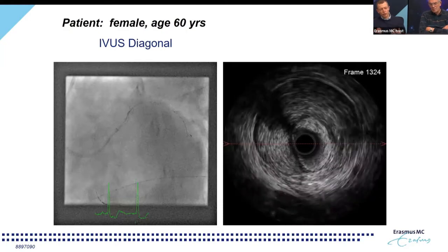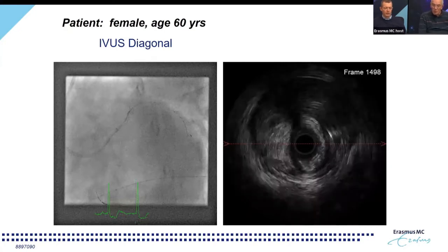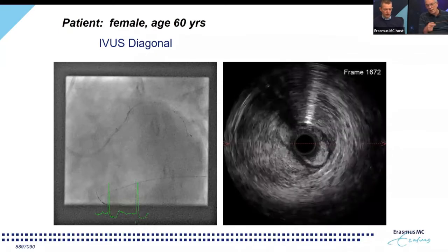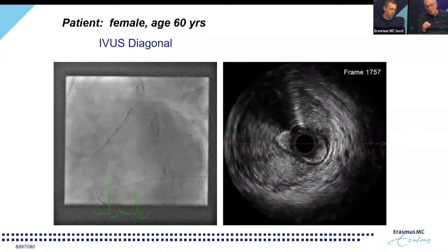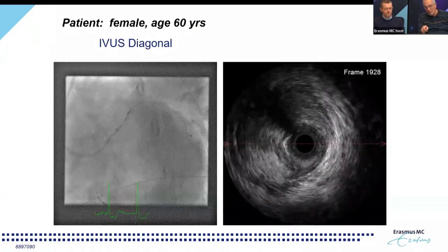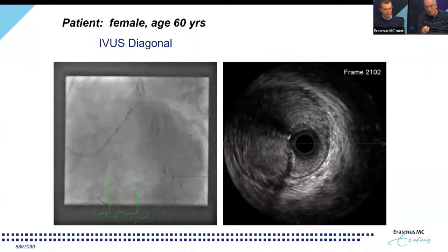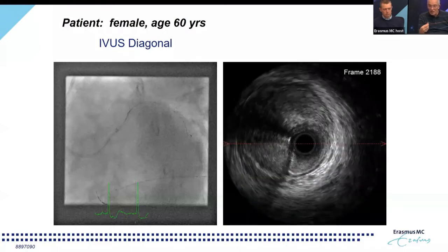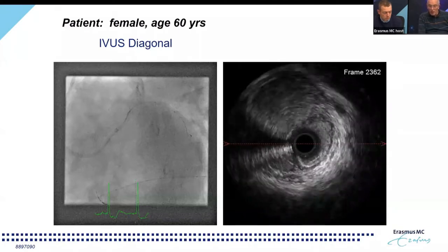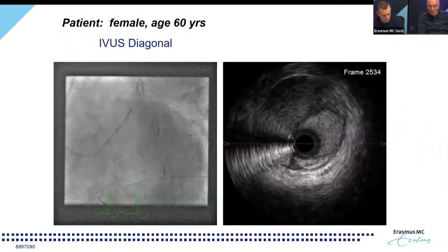is already a moment of relief, because at that point you know the wire and also this IVUS catheter are in the correct lumen. Then it's a matter of appreciating the enormous amount of hematoma, with a vessel that is now approximately, I think, 7 millimeters. But you also see sometimes in the true lumen where the catheter is that the IVUS catheter blocks the vessel, so that you have non-moving blood in there, because the narrowing is so severe. No problem. After the pullback, you remove the catheter immediately, and then you can appreciate your pictures.